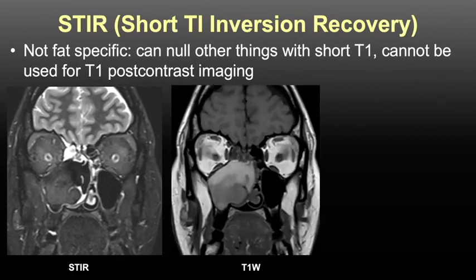In fact, no. If you look at the T1 pre-contrast imaging here, you'll see that this area in this expanded sinus, which is a mucocele, right, contains this very, very thick proteinaceous content that makes it have a shorter T1 relaxation time. In fact, that T1 relaxation time is so short and so similar to that of fat that it got completely suppressed out on this STIR image.